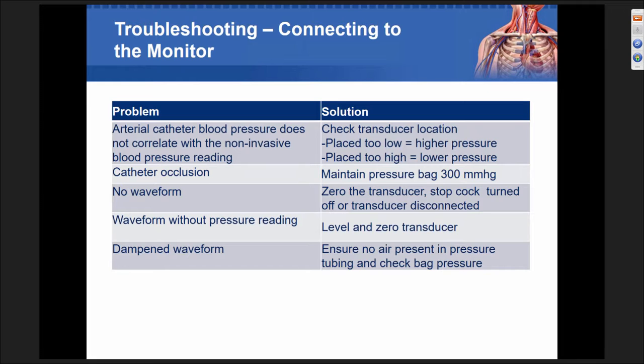If you have patients that have this septic picture, the best insertion location really is femoral, because remember what the body's doing. It's the compensatory response to constrict and just shunt blood to the torso area and to the trunk. And that allows femoral to give you a more accurate blood pressure.